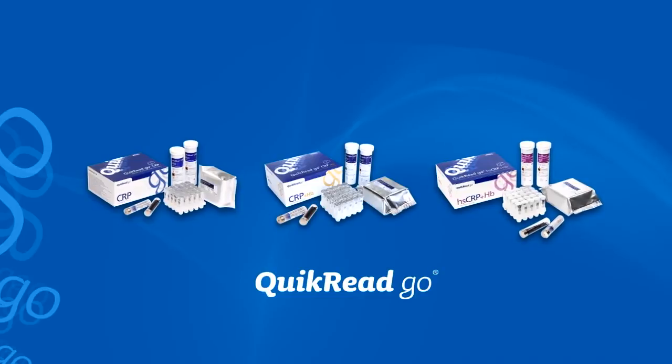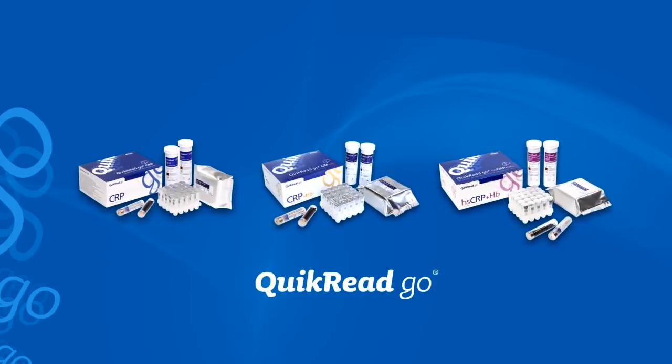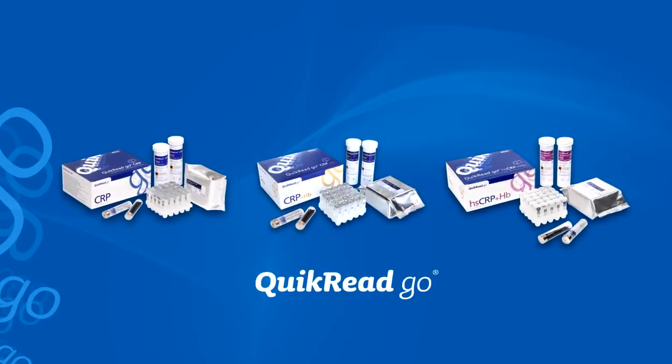All the different Quick Read Go CRP tests contain similar sets of components, differentiated in the labelling with product names and colours. The testing procedure of the different CRP kits is identical.